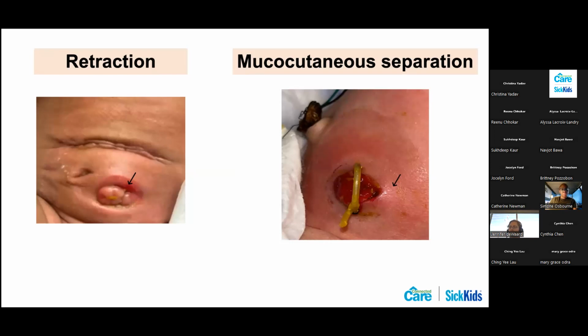This is a loop stoma, but there is a little separation between the skin and the stoma where the sutures were. We use stoma powder and Cavilon, or a barrier spray, to fill in the area, to act like a bandage over it to protect it from effluent getting into it, and then put our barrier ring on top.